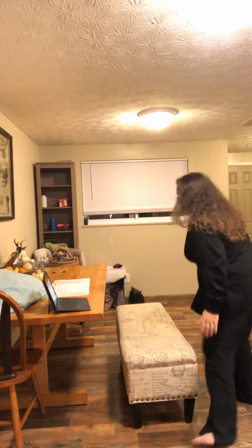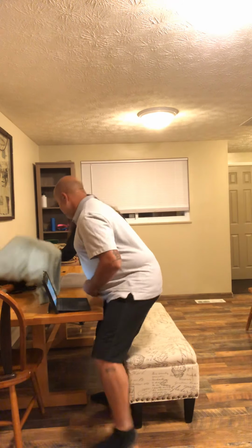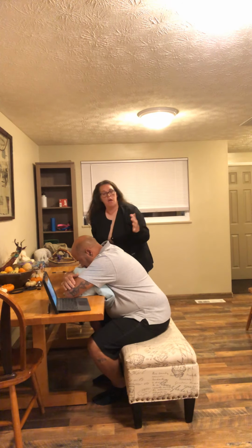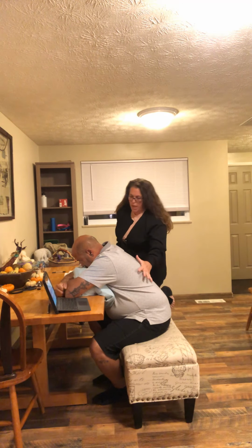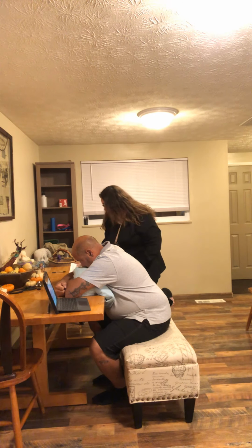So now I'm going to have my patient come in. We're going to look at how the patient would be positioned. Patient, come in, have a seat. Here at the table, you're going to have signed consent. We're going to have cleansed your area with chlorhexidine. This is the area that we're going to be looking at here. Hopefully we have an ultrasound guided technique, and this process is sterile.